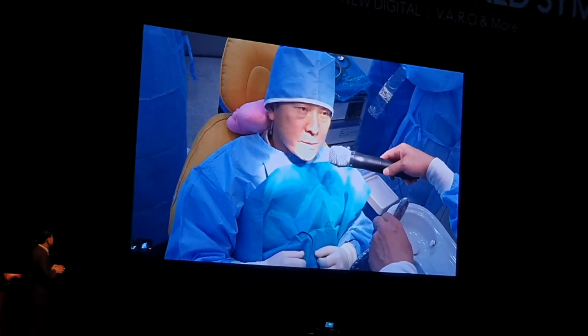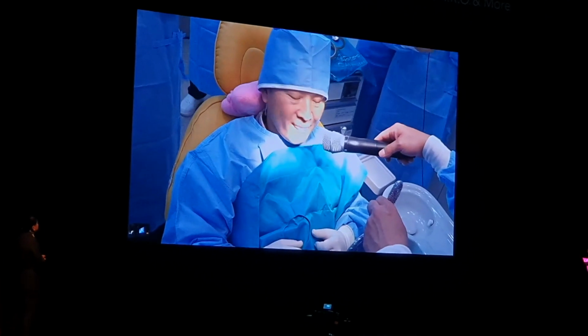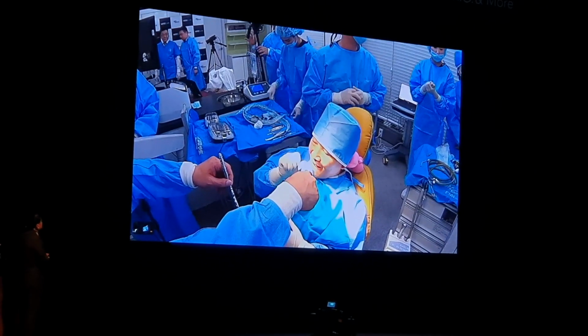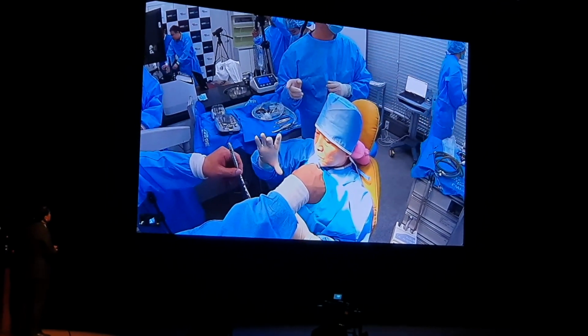Yes, you can't do it yourself. Is it almost done? The guide is still milling, so we are all prepared for the surgery here, and the patient is under anesthesia. Perhaps a bigger mirror would be nice. Can you find a bigger one?